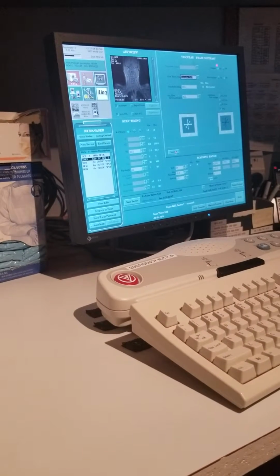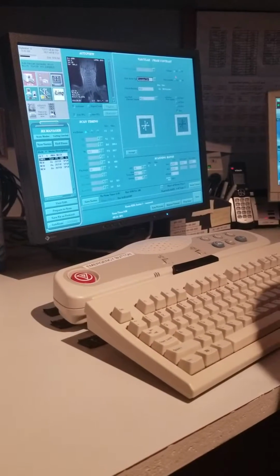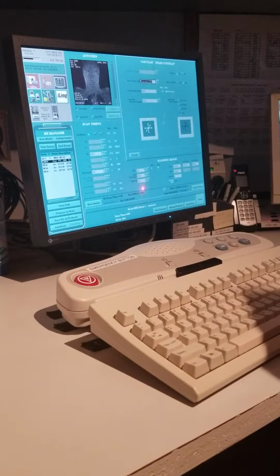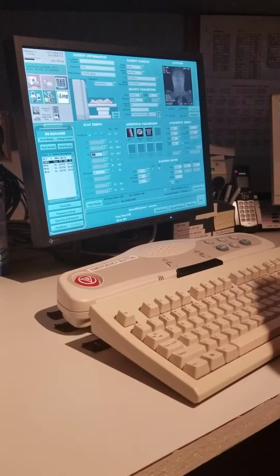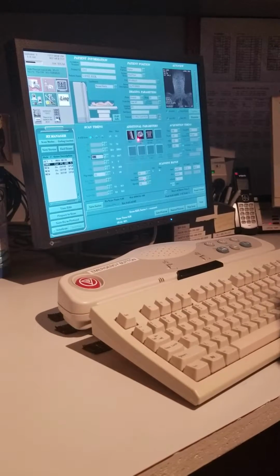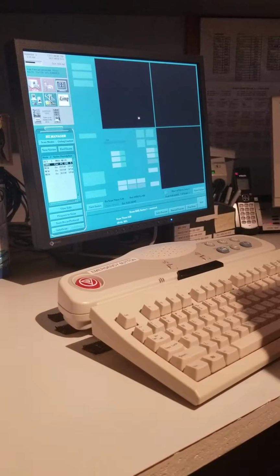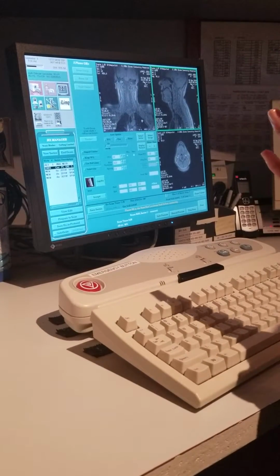And then you see how it says a collapsed image? It'll do the scan and it'll just create one image for you. So go ahead and hit accept, and if you notice the slice thickness is 60 millimeters. So you're going to go into graphic and shift click, and you're going to wonder what the hell is this, because you're going to get one picture, one slice.